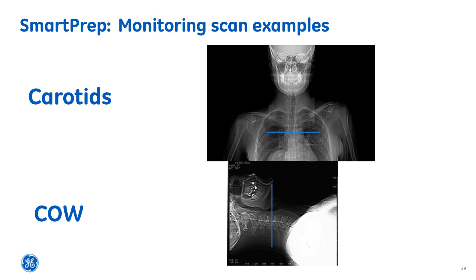So if we were interested in scanning our carotids, we're probably going to go from the arch of the aorta, because we're going to want to see the origins of the carotids. Now if we were imaging a circle of Willis, because we don't want a huge distance for the table to travel, we're going to want to image over the carotids. So if we see contrast in the carotids and we hit go, it's then got a shorter distance to travel up to the circle of Willis than if we, say, triggered from the same place as the carotids.